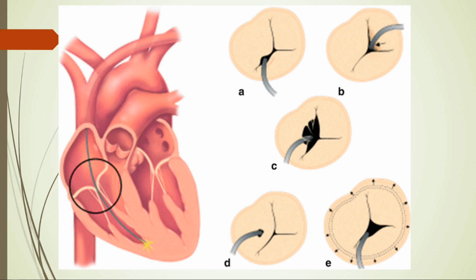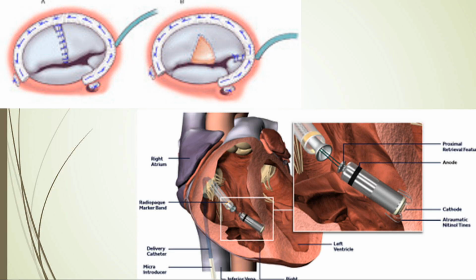When is it valuable to take it out and take a risk of removing a lead and putting in leadless pacemakers? When is it that just pushing it against a ring, something that we have not been doing in the last couple of years, would be the best thing to do? That also might require some guidelines.